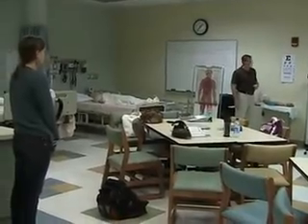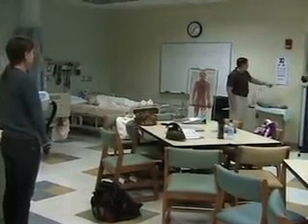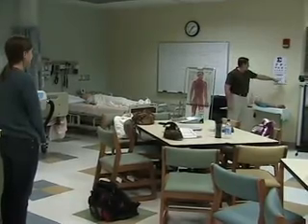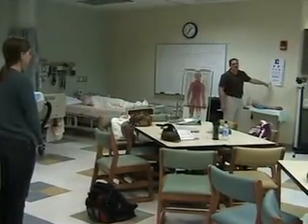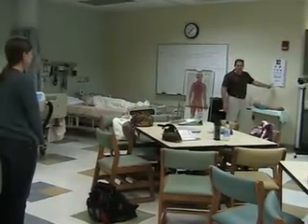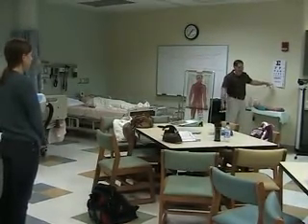L-E-F-O-D-P-C-T. That's 20-15. Now, what is average vision? 20-20.